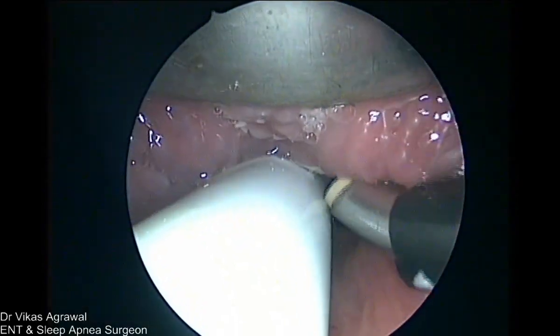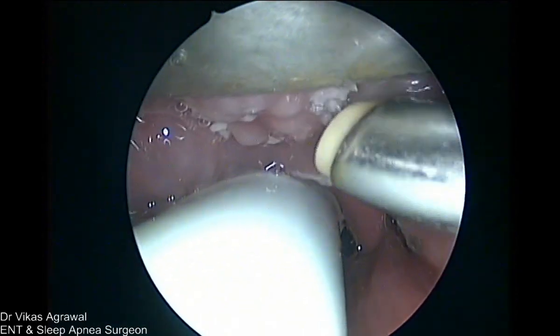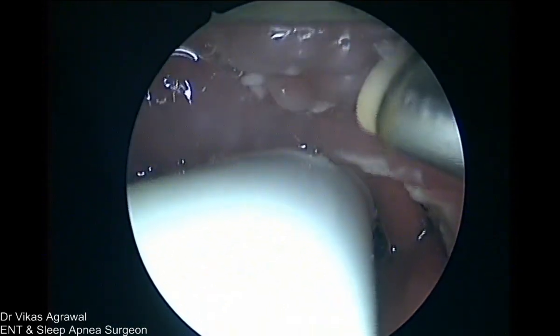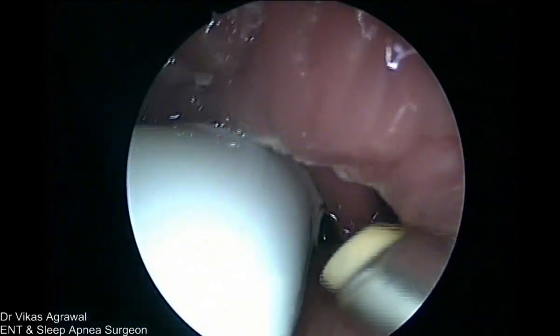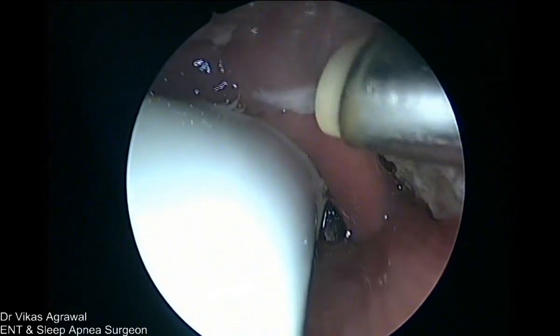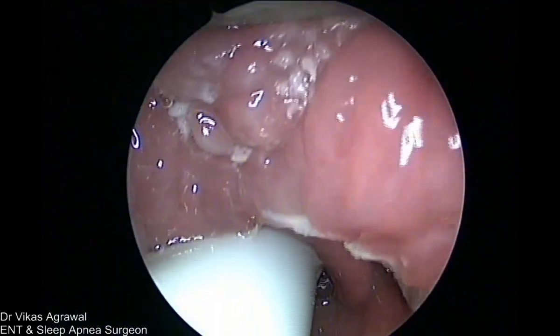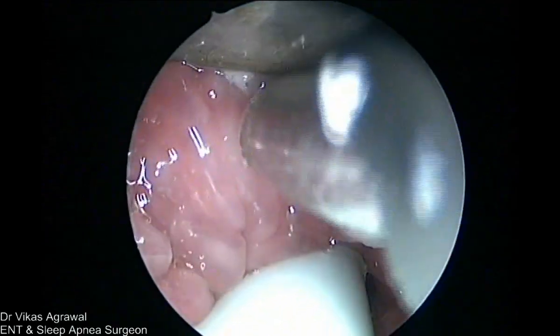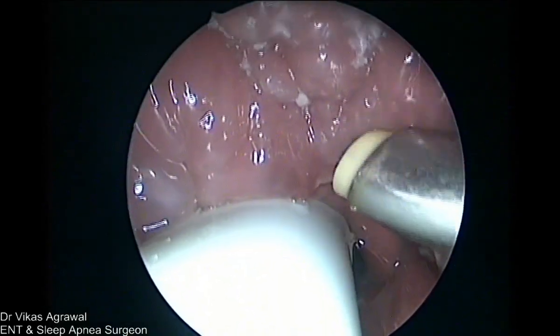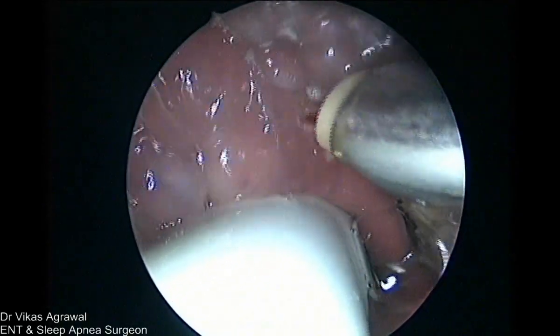There is still some amount of tissue here. Can you see this? This is the foramen cecum. This is the anterior two-thirds, this is the posterior one-third. A little bit of tissue is still left here, which I'll remove. Can you see the foramen cecum very well? Correct. So I'll remove this tissue.